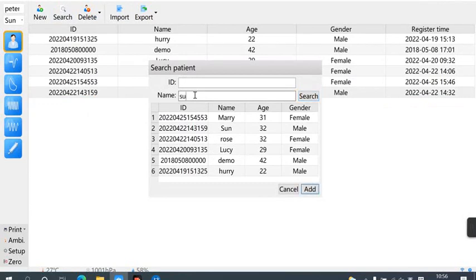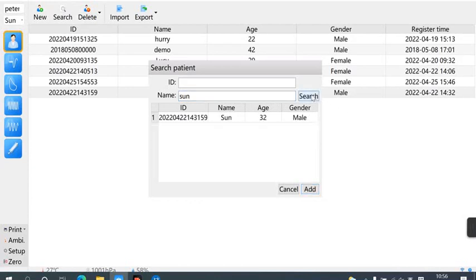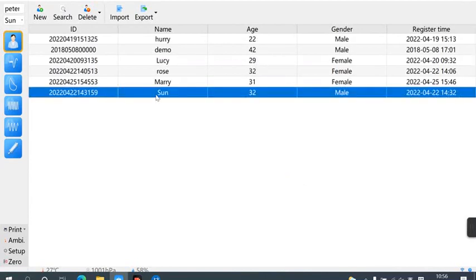If there are too many samples, you can also enter the corresponding name or ID in the search box. Click Search and select the sample. Select the sample and click Add to add it to the main column.